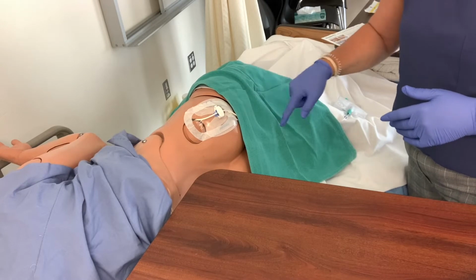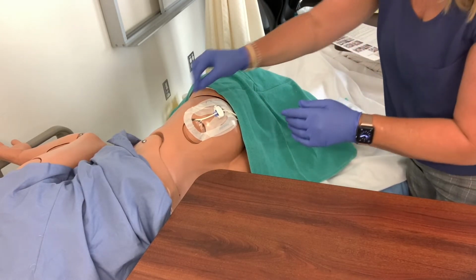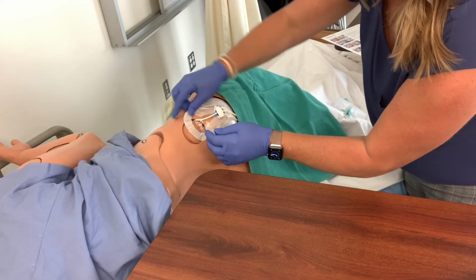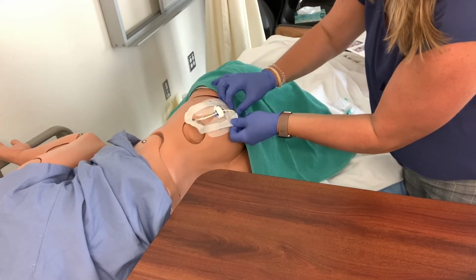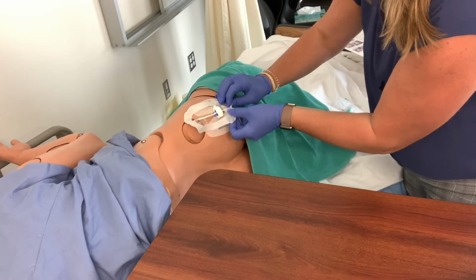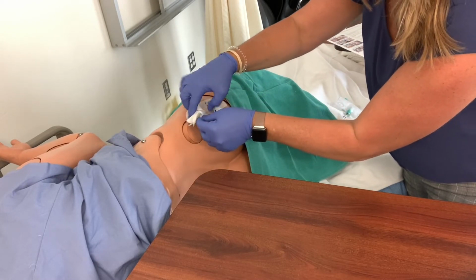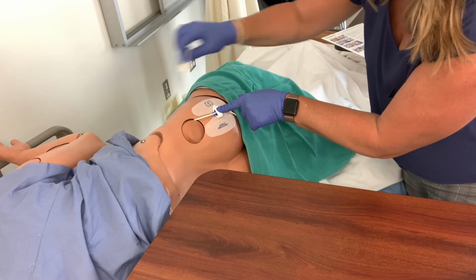As you can see, I've draped my patient with my sterile drape here. I'm wearing blue gloves, so I'm now going to carefully remove this dressing. Just be careful, this is not the correct dressing, but this was the only one I could find that would work. Whenever you take it off, be careful that you don't dislodge anything. Come towards the site of the insertion and carefully remove your dressing.